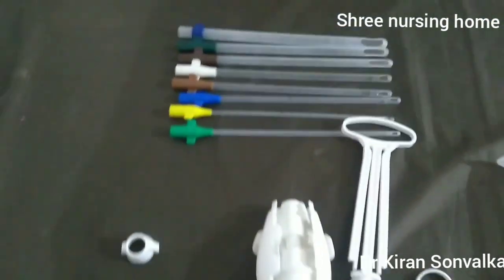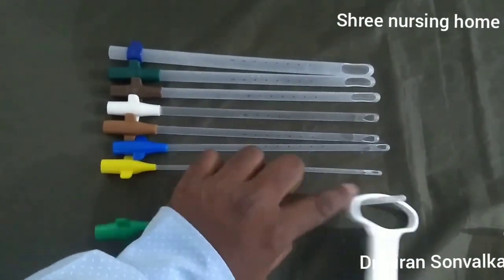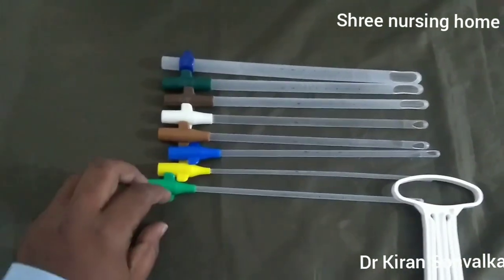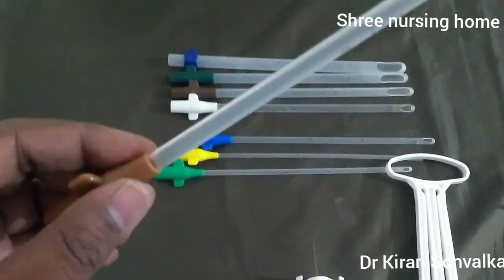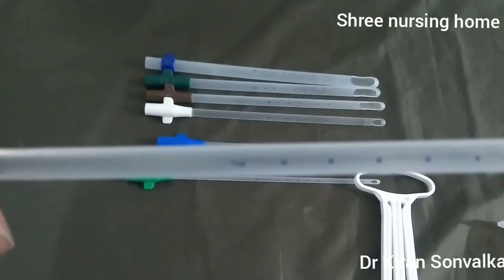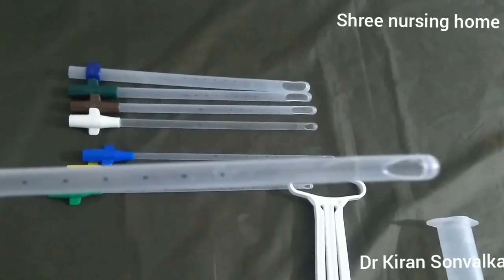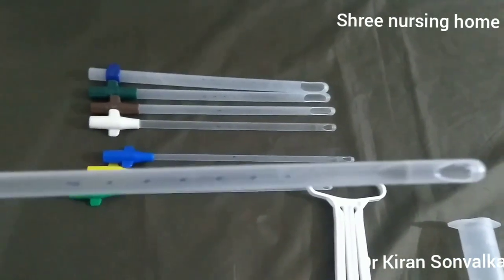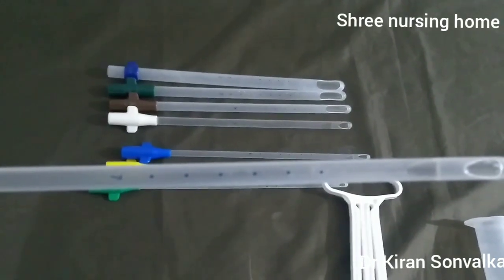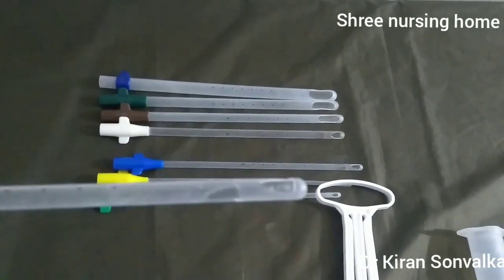These are different plastic cannulas which have different color codes, starting from number 5 to number 11. On each plastic cannula there is a number written — for example, number 7 is written on this one. There are dots: the first dot is six centimeters away from the tip, and after that, dots are one centimeter apart, so you can measure cervical length and uterine length using these cannulas. There are two apertures on the tip of the plastic cannula.